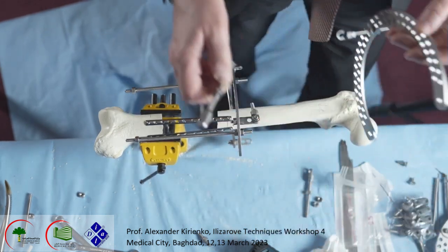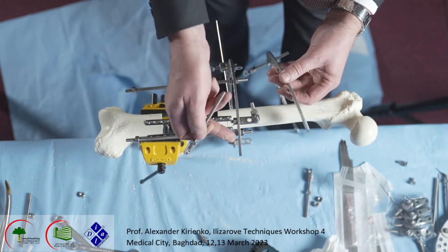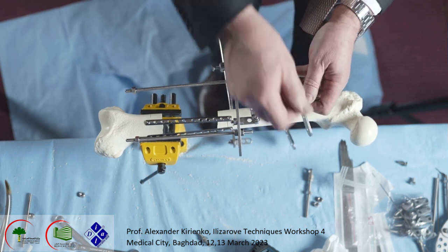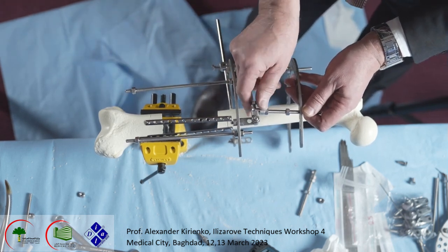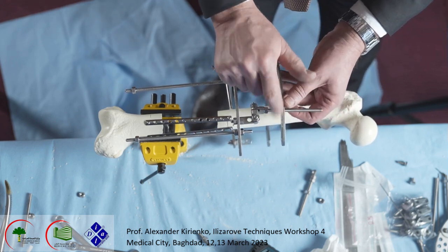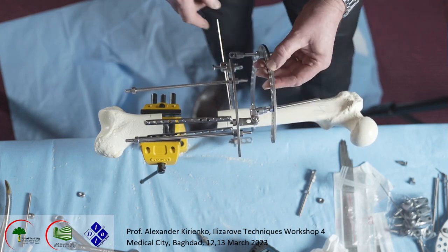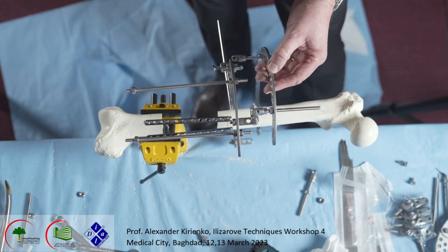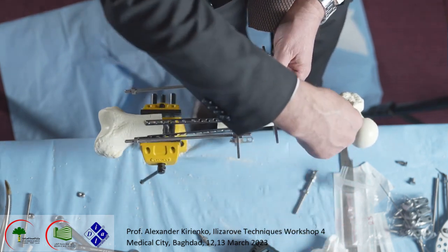What I do, I put this. I respect the same holes. This is 3 holes here. I put in the same hole here. I touch like this. I put it near because we need to do lengthening. We may do like this, but maybe it's not so comfortable for the patient. And posteriorly, I do it differently.